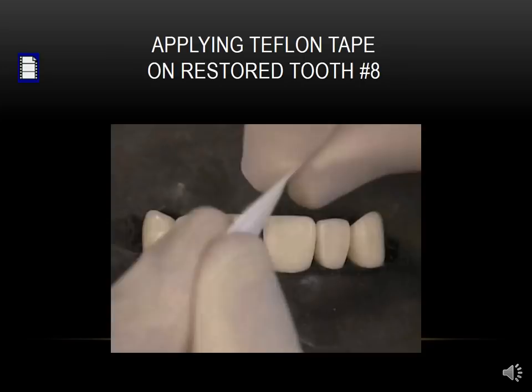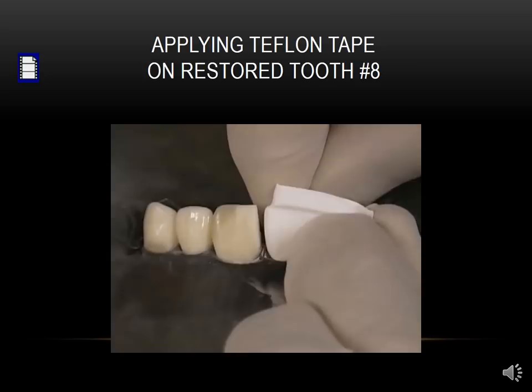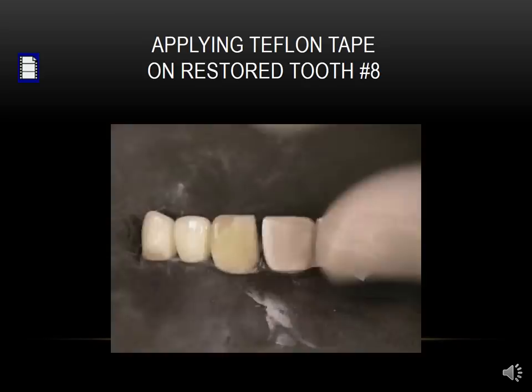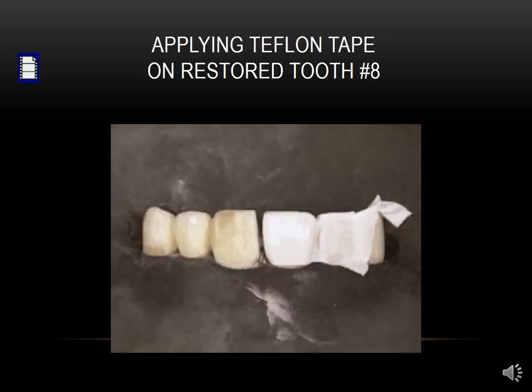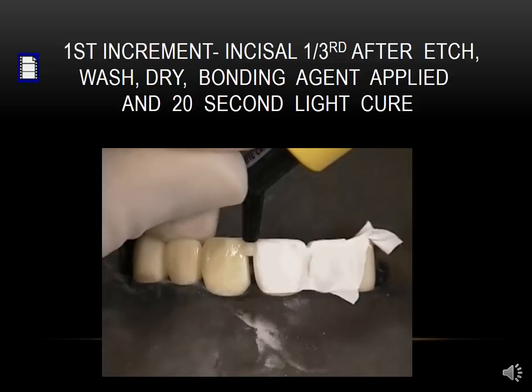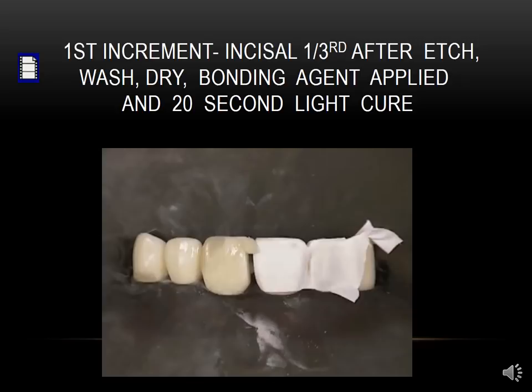Then we take Teflon tape and protect the tooth we've just restored by wrapping it with the tape, crimping it in the interproximal area with your nail. By building to that very thin Teflon tape, we will have a contact and won't be adhering to the previous restoration. Then we go through the same procedure with etching, washing, drying, bonding agent, and 20-second light cure. Now we're ready to place the incisal third of the second restoration, building it as the mirror image of the one previously done.